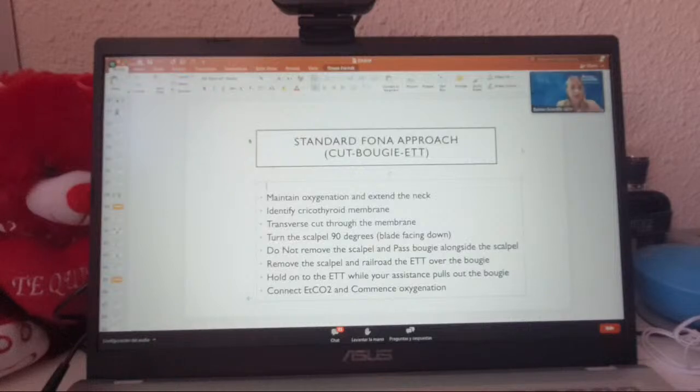Yeah, so there's another question. Video laryngoscopes are usually bulky and sometimes difficult to insert with a small mouth opening. What's your experience? My experience, I don't use the commercial ones, but there are modern devices. There are pocket devices like the McGrath, for example. They are very, very small. There are size 3 blades. For me, I've used them with an inter-incisor distance of about 2 centimeters. I didn't have a problem with that.